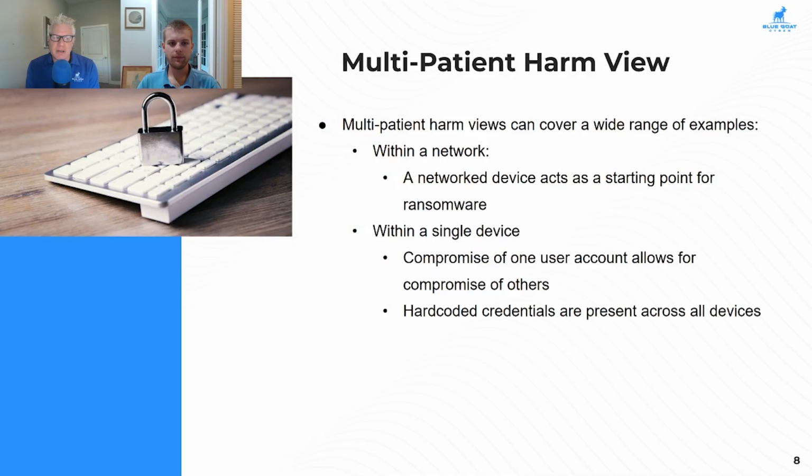Yeah, that's a good point. I know some of our clients have a system on the cloud that multiple healthcare delivery organizations connect to. And it seems like the likelihood of having multi-patient harm on that one, since it has multiple patients on the cloud, is more than like a drug infusion pump, as an example. I know I didn't provide all the context for your answer, but if I look at it through that lens, I would say it's more on the cloud based than the drug infusion pump. Definitely. Yeah, there's a lot more that can go wrong on the cloud side of things. And so it's more likely that you'll have problems.